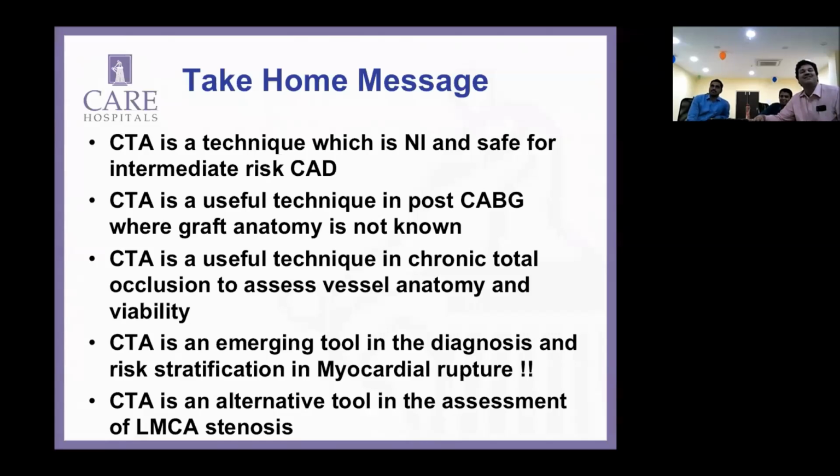CTA angiogram is here to stay, but availability is the issue. For example, here in Tirupati, we have only one center where CTA angiogram may be done, that is SWIMS, but it is done by radiologists and the reporting is patchy and we are unable to rely on it. So such are the issues here. It's easier to do CT than maybe MR, but there are a lot of limitations.